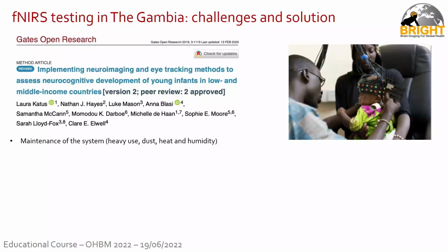There's a lot of dust, there's a lot of heat, there's a lot of humidity. So we had to be in touch with the system providers a lot to understand how to care for the system a bit more than what we would normally do. You have to take into account transportation, as I showed you in the video earlier.